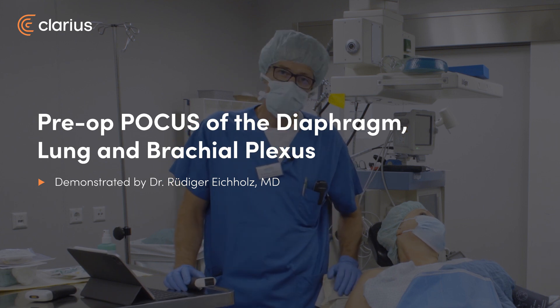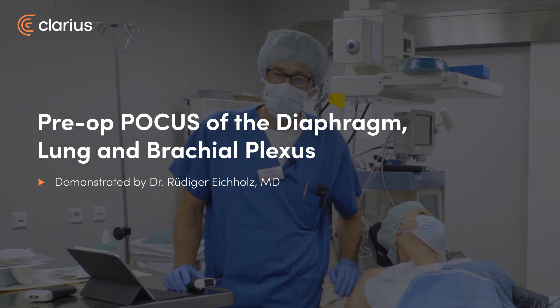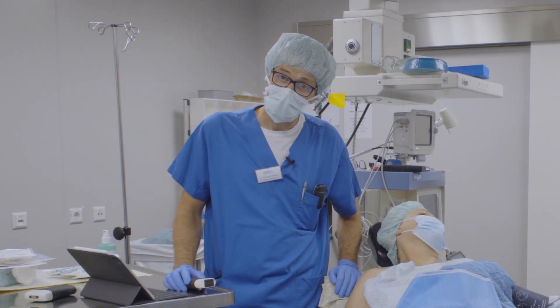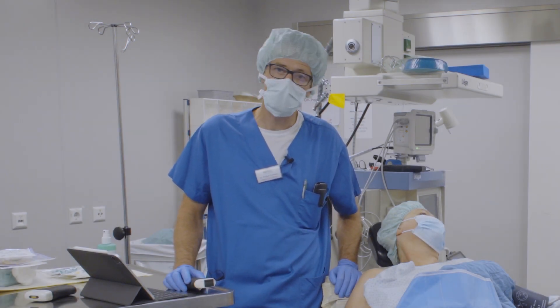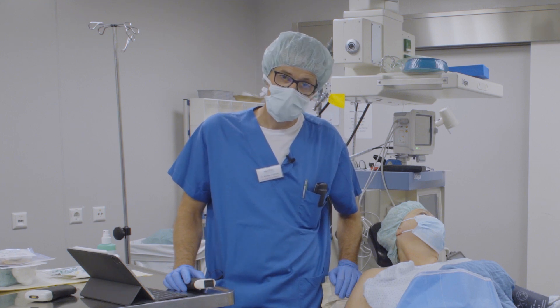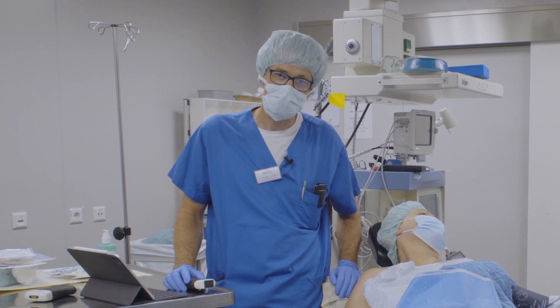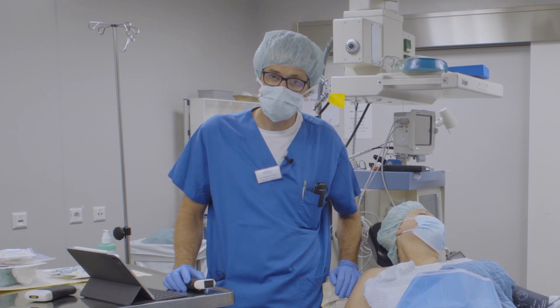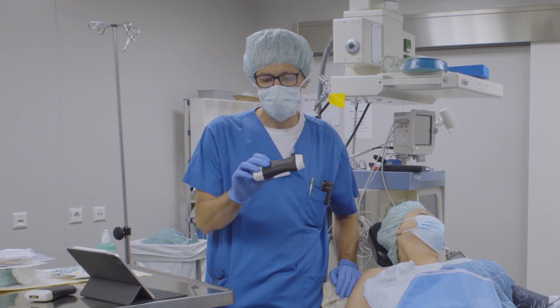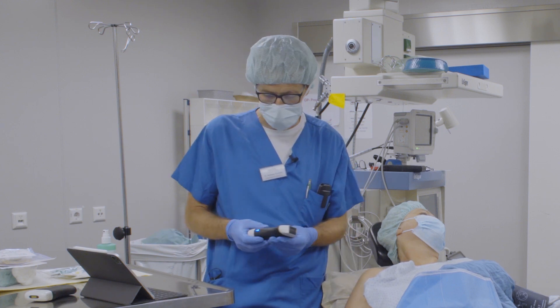My name is Rüdiger Eichholz. I'm from Stuttgart in Germany and we're here in the Bodensee Sportklinik at Friedrichshafen at Lake Constance. This is an orthopedic clinic where we do shoulder surgery, and every patient gets a regional anesthesia. We're using a Wi-Fi connected probe linked to a tablet.